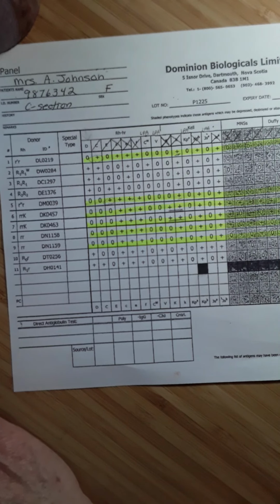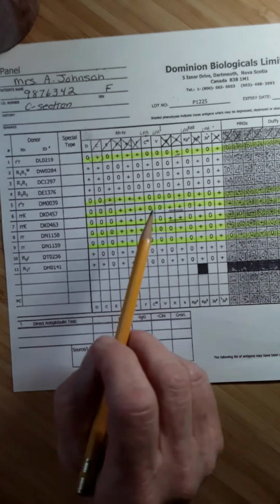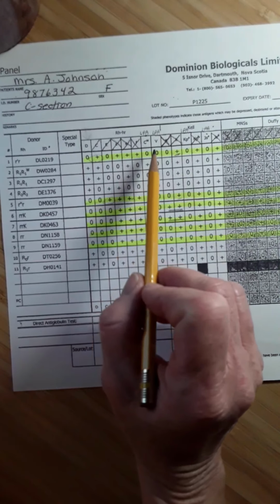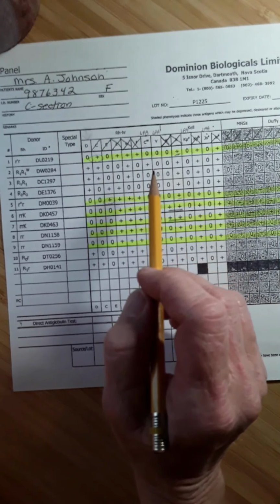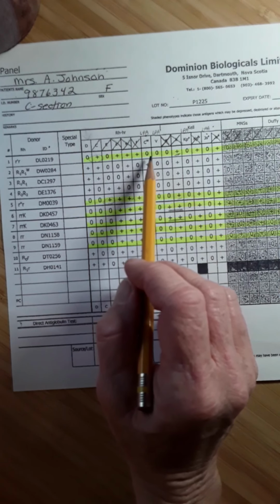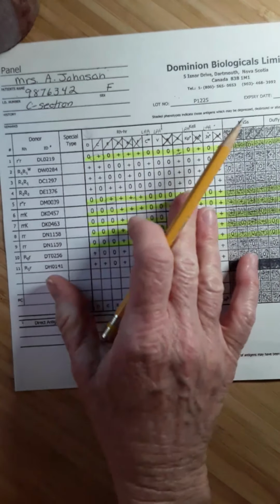Now, if I had some sort of reason to believe that an antibody to a low prevalence antigen might be present, and I'll explain that in a minute, then I would pursue it. But otherwise, we don't worry further about antibodies against these low prevalence antigens. It doesn't mean I'm excluding them. It just means that I'm not going to worry about them further. Very, very uncommon to find an antibody against a low prevalence antigen in our patients. That's explained in the module, so I'll talk about that again a little bit later as well.